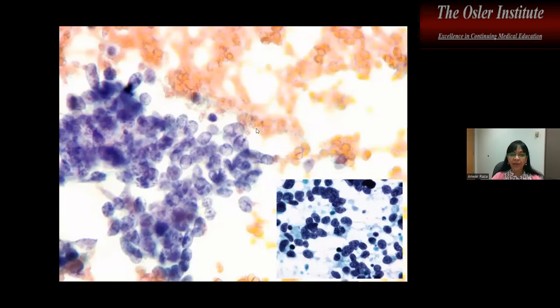All right, so what about this? Here's a tumor. It's very cellular, and what you see is the chromatin is coarsely granular. Buzzword here, salt and pepper chromatin, right? And there's not much cytoplasm. There seems to be a bit of molding going on. So this is a classic example of small cell neuroendocrine carcinoma. And so even though it's called small cell, these tumor cells would be about 2.5 times the size of a lymphocyte nucleus. Here's a lymphocyte, and look at the small cell over here, right?